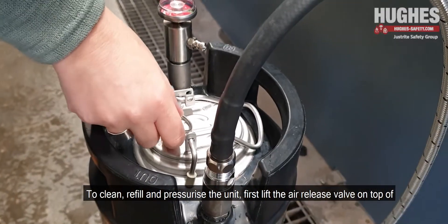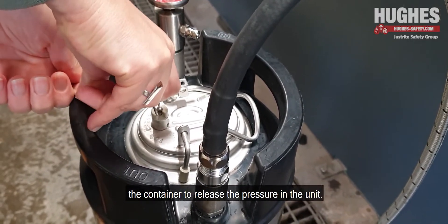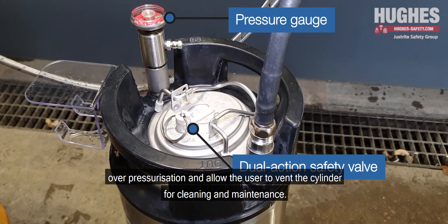To clean, refill and pressurise the unit, first lift the air release valve on top of the container to release the pressure in the unit. This dual action safety valve and the pressure gauge prevents over pressurisation and allows the user to vent the cylinder for cleaning and maintenance.